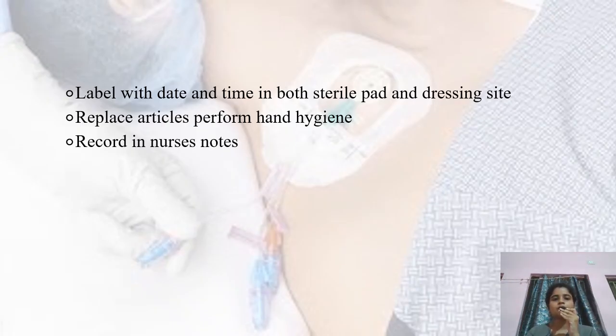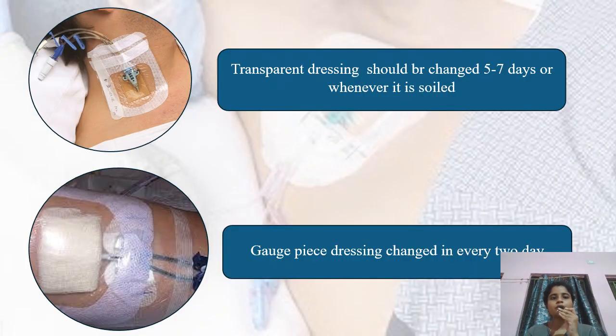So these are all the steps that you need to follow while doing central line care. Coming to the dressing, you can see this is the Tegaderm, a transparent dressing which is put. This transparent dressing, if it is not soiled, you can change every 5 to 7 days, or whenever it is soiled. Whenever you see that soiling is there, you should immediately change the dressing. And here you can see the labeling.